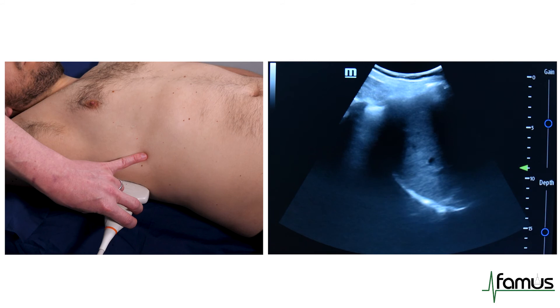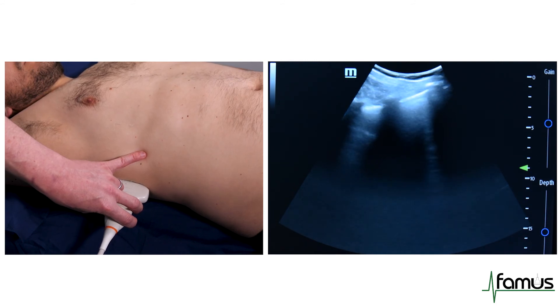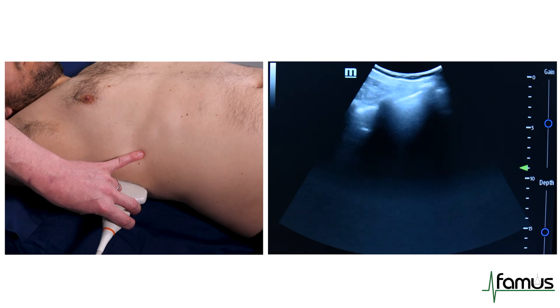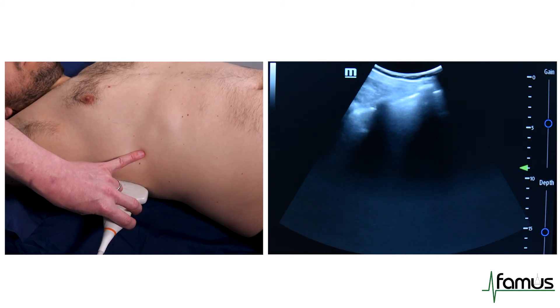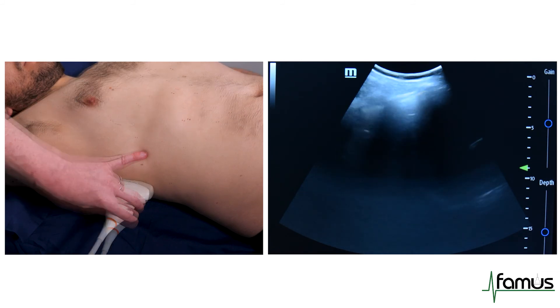The other things we can see in this image are the spine coming in at the bottom of the picture, and also when our model breathes out you can see the kidney coming in from the bottom right-hand side.